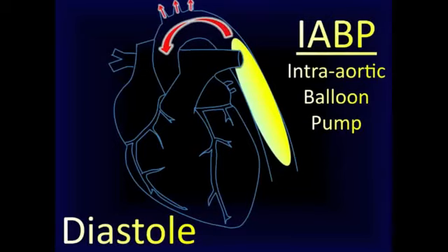Hey, welcome everyone. This video will introduce us to the intra-aortic balloon pump as well as the aortic pressure curve that is associated with it. Now, while several forms of mechanical hemodynamic support exist, the balloon pump has easily become the most popular, and we'll go over the really important concepts to know about the pumps.